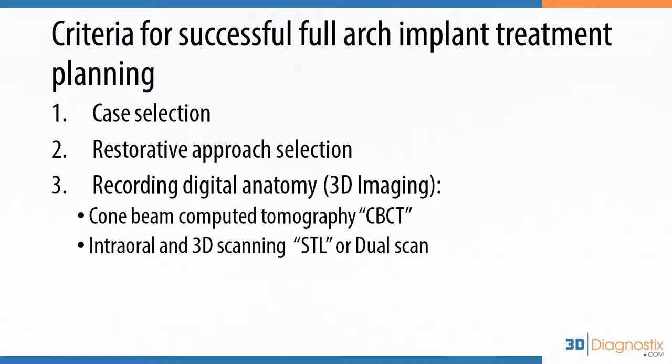We should be moving forwards for point number three here, which is recording the patient's anatomy using 3D imaging. And we'll need A, a CBCT scan exported in DICOM files, and B, a surface scan or an STL file, which will be obtained from either scanning a model, an impression, or you can get that directly from your intraoral scan. When it comes to completely edentulous patients, we will have more focus on the dual scan as mentioned before.